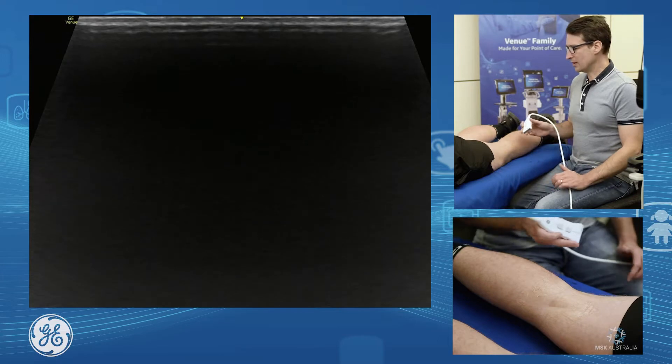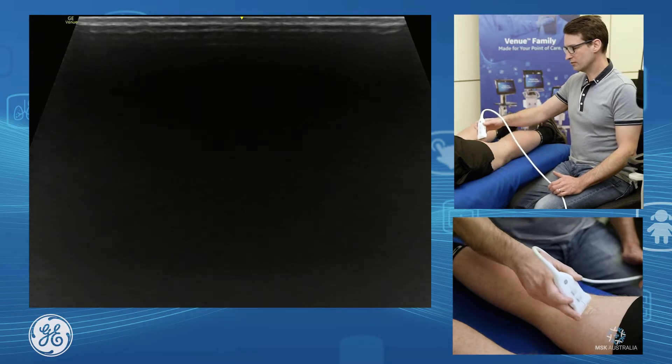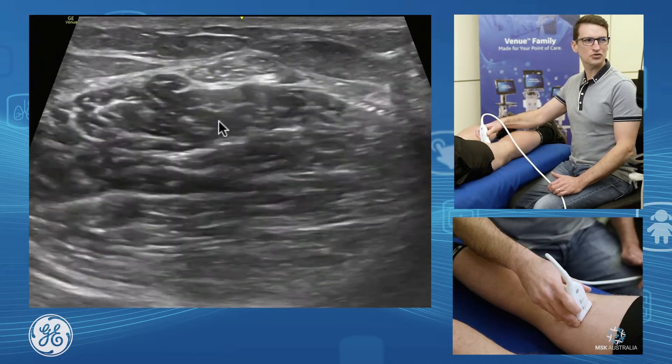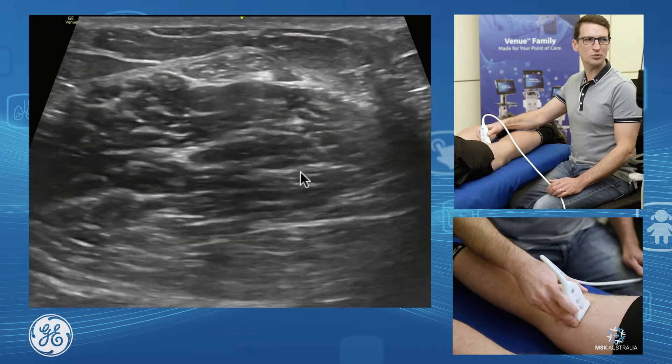Posterior knee — we're going to pick up our two medial hamstrings. We'll be on the posterior thigh, medial aspect, and what we'll see here is almost like the cherry on the pudding. We'll have our semi-tendinous tendon sitting up over the top of our semi-membranous muscle belly.